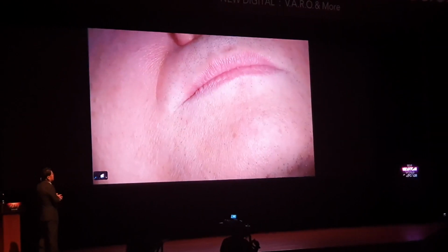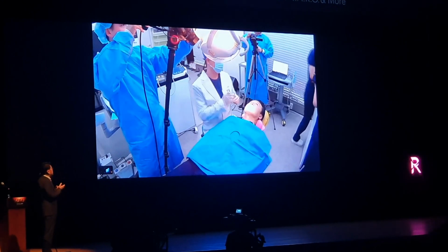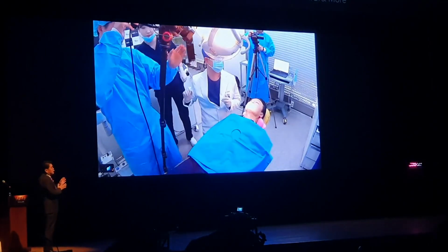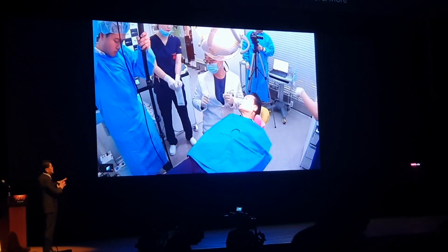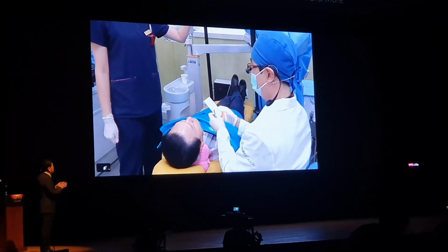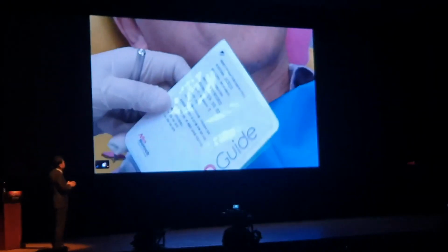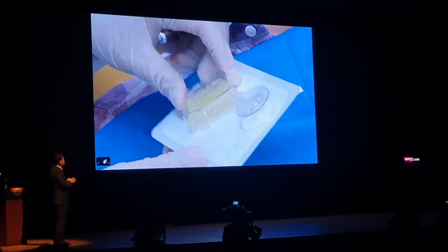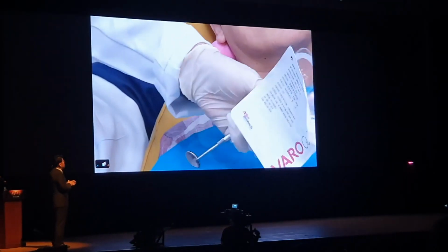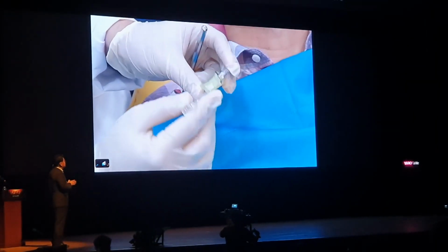Okay, please give me the PGS13. This step is very important. I'm using the VARO guide myself. Before the actual use of the pre-guide, we want to make sure the guide is positioned perfectly. So we test beforehand by fitting the trial tray. PGS13, is it? Yes, PGS13. I'm going to open the PGS13. As I open, you can see the thin vinyl layer, and inside is filled with the composite resin material. It's a light curing resin, is it?